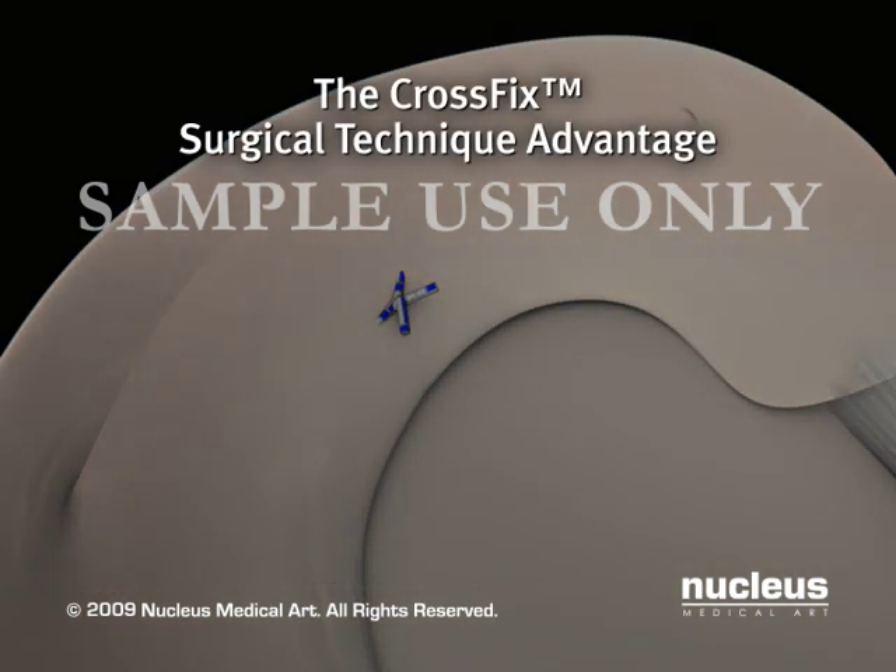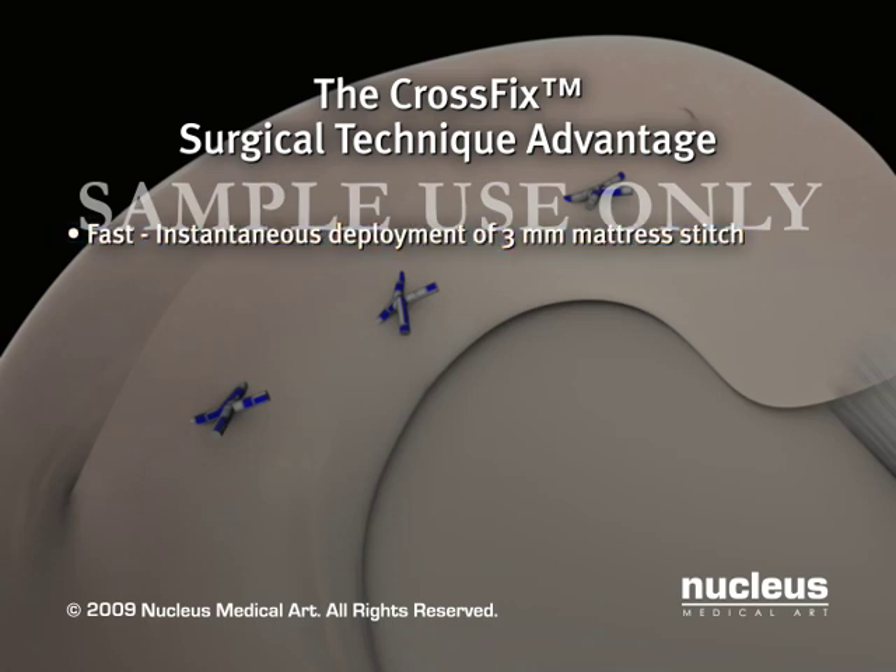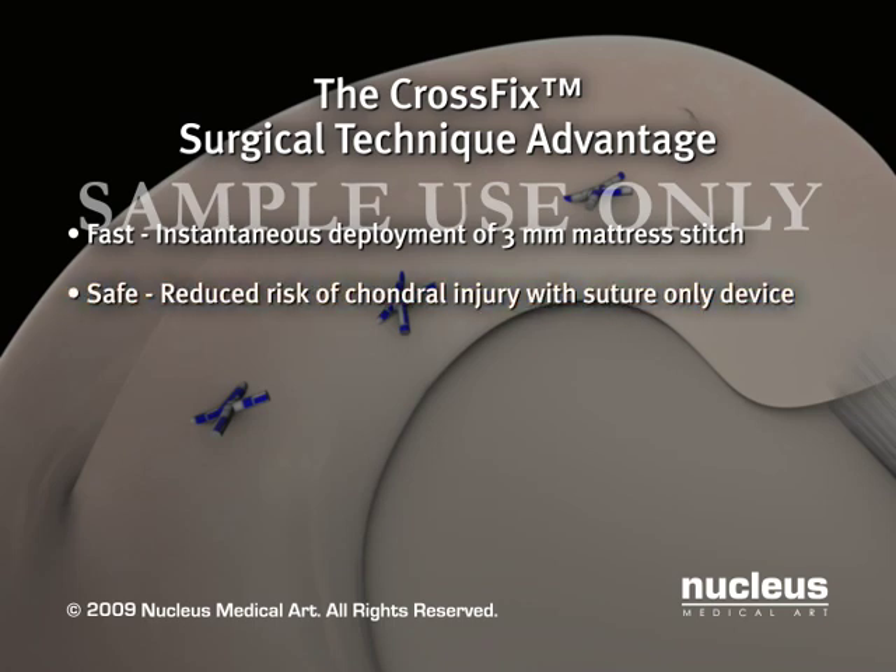The CrossFix surgical technique offers surgeons a complete solution for meniscal tear repair. The all-inside technique creates an instantaneous 3 mm mattress stitch with a single insertion into the meniscus and pre-tied sliding knot. The suture-only device reduces the risk of chondral injury common to implantable plastic devices. The technique is fast and easy, resulting in reliable and reproducible outcomes.